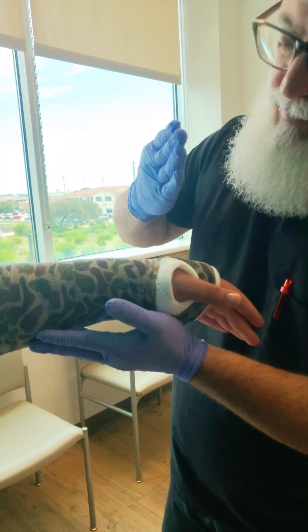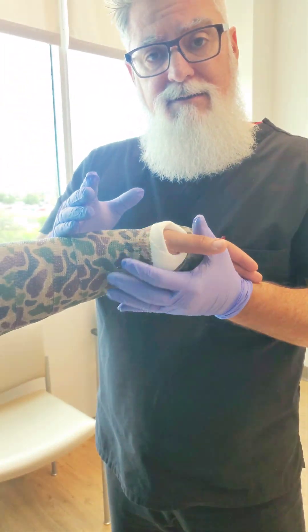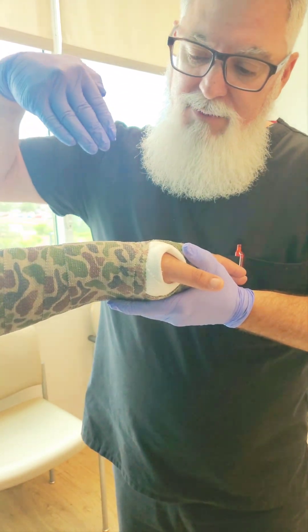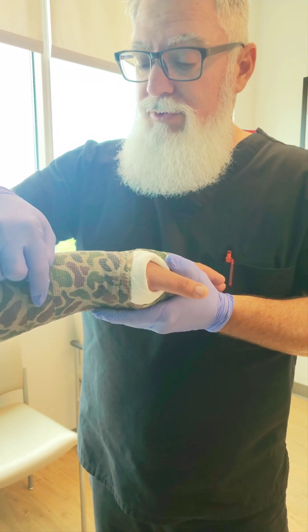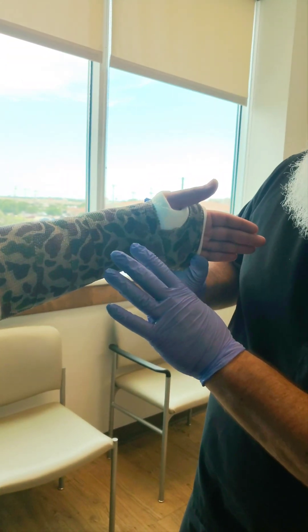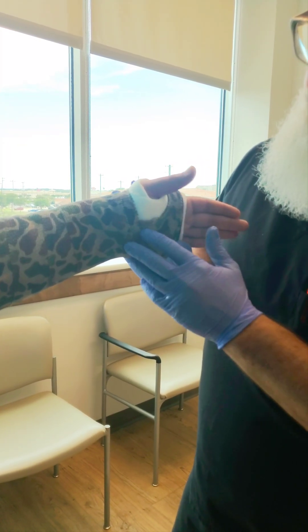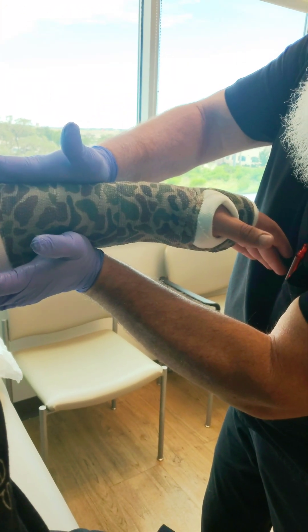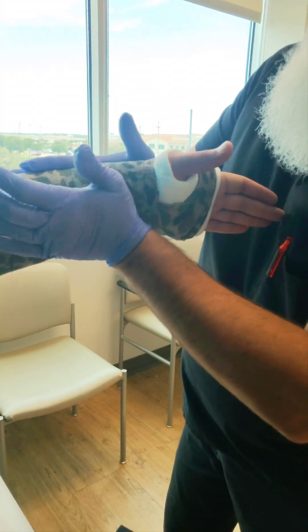Just in the opposite direction — this part would be bent down. That is called a dorsal mold, or some surgeons would call it a volar apex mold if the bend goes that direction instead. So this is the closing of three videos covering all three molds: the interosseous, the ulnar deviation, and the volar.